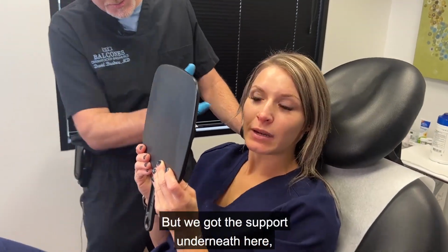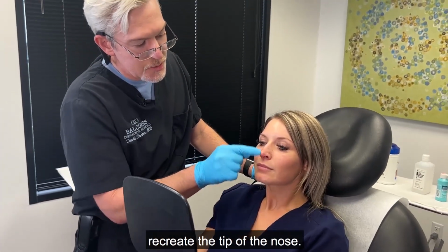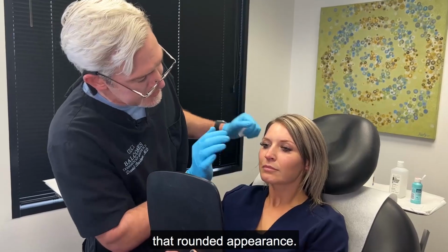I didn't change it too much, but we got the support underneath here, and so it kind of lifted that up. And then we added a little bit just here to the tip of the nose, recreate the tip of the nose. Just a little bit here in the middle, and then a little bit on either side, just to kind of give it that rounded appearance.